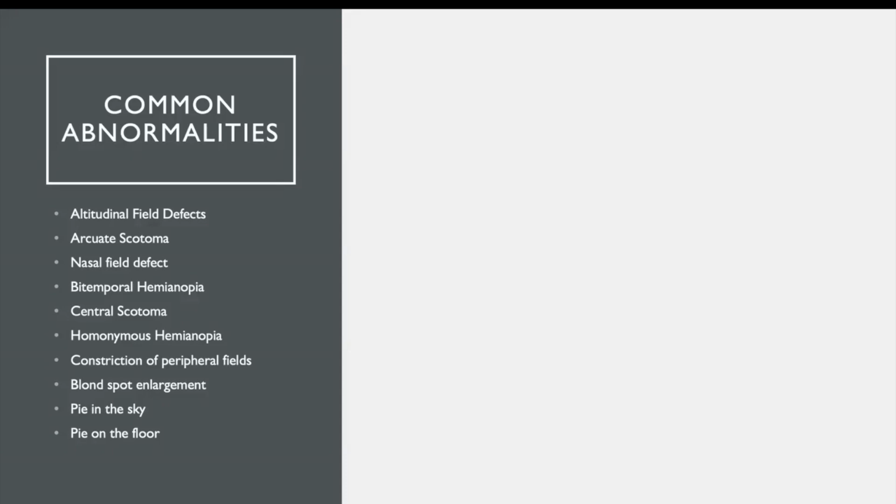Are they symptomatic? Do they have any associated symptoms? And what does their eye look like? Have you assessed their anterior segment, their posterior segment? What does their disc and macula look like? And then you can look at that visual field in association with that.